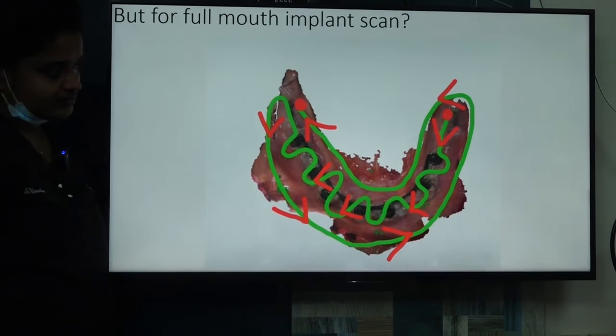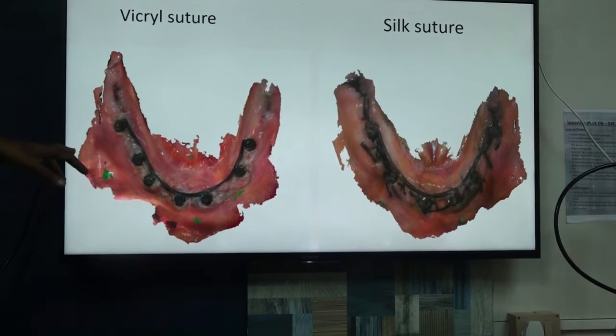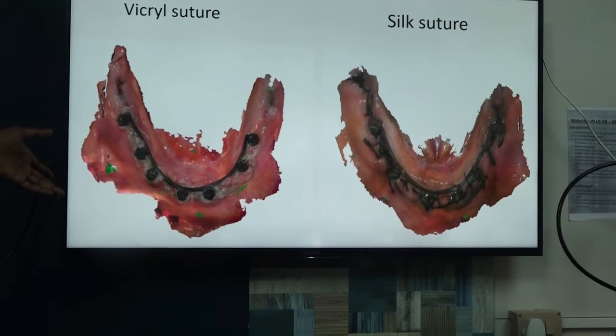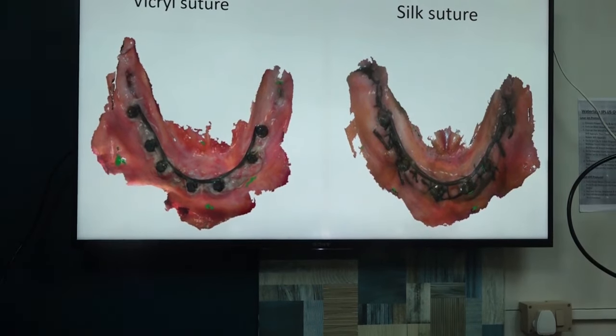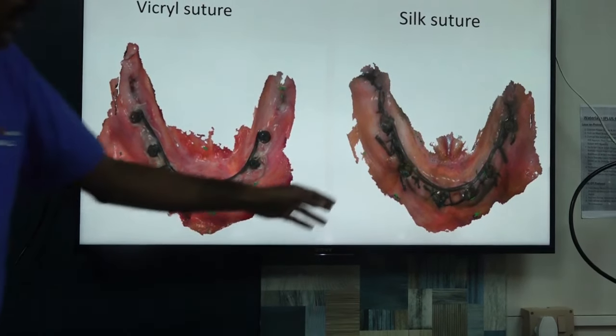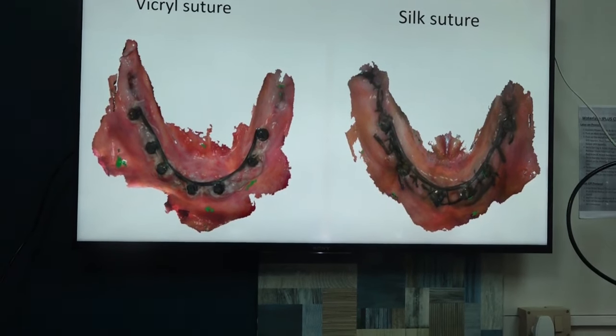Okay, next one. Here we did vicryl suture. This is the second day. Second day means surgery was the first day, and the second day is this picture. Almost all the sutures are dissolving. Here it is a silk. What is the plus and minus of silk?